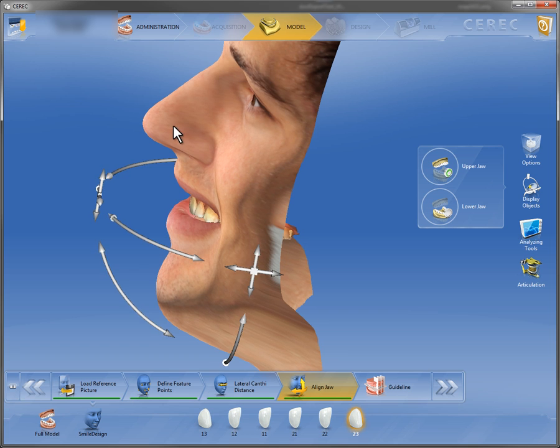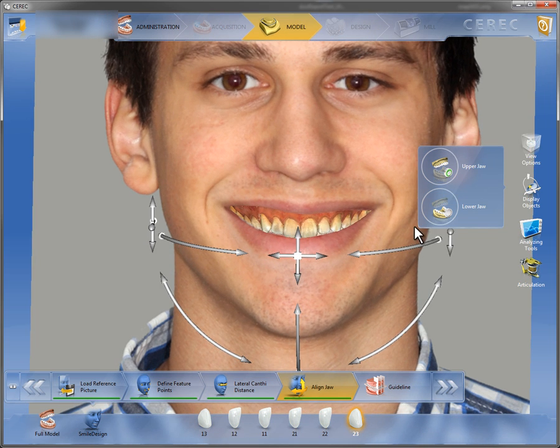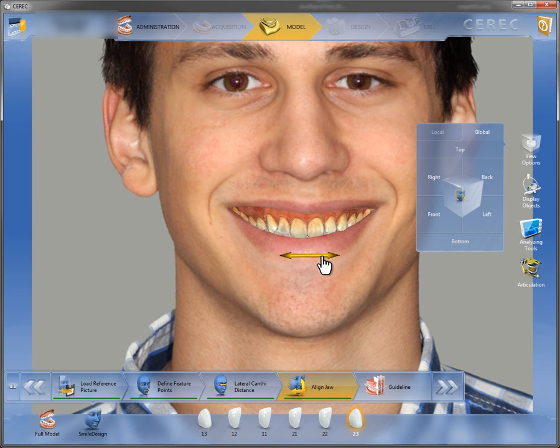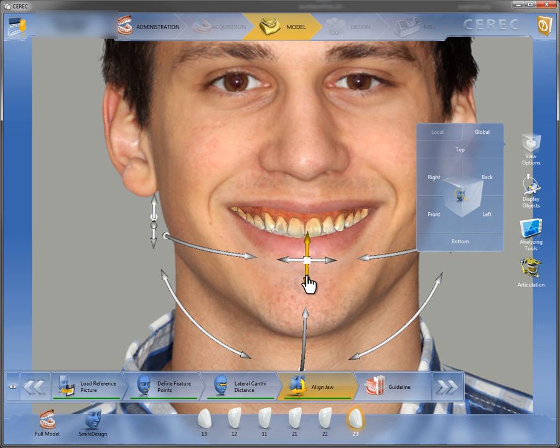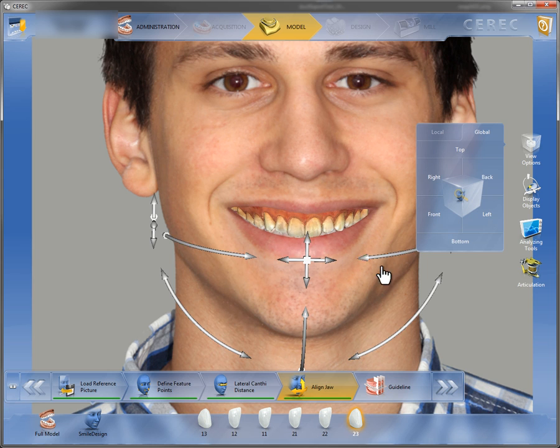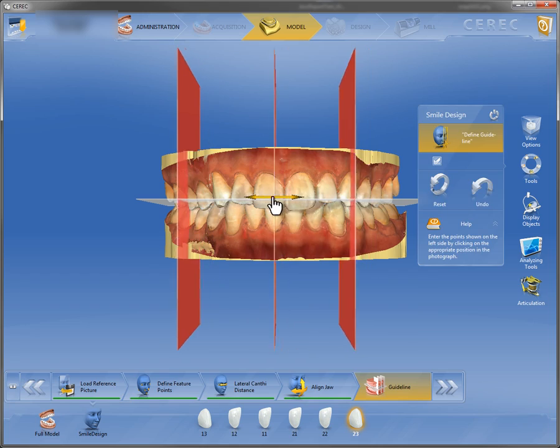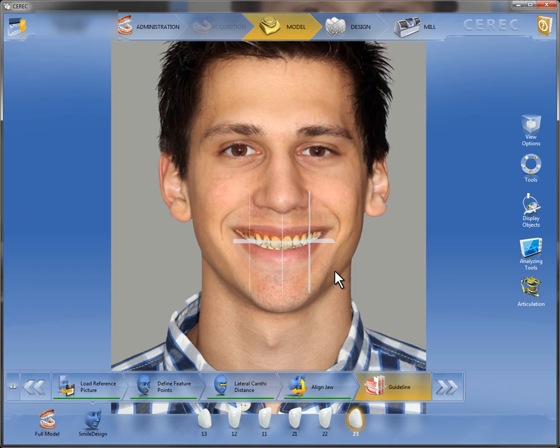As the patient portrait is a pseudo 3D model, it can also be checked from the side, from above, or below to fine-tune the positioning of the 3D model. The fact that the orientation planes are shown also makes it easier to align the model properly.